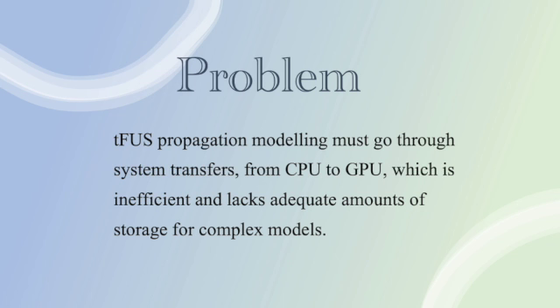The transcranial focused ultrasound propagation modeling must go through several system transfers from CPU to GPU, which is inefficient and it lacks adequate amount of storage for complex models. This problem can be solved by a combined CPU and GPU processor that allows for the CPU to perform complex operations and store this information with access to the GPU space. This is where the Apple implementation comes into play.